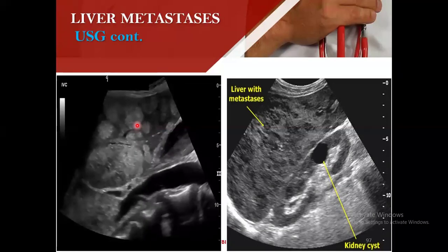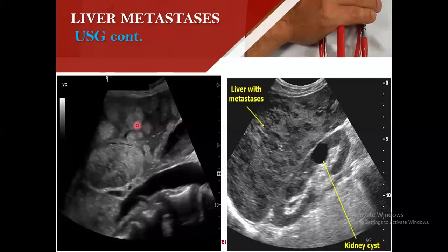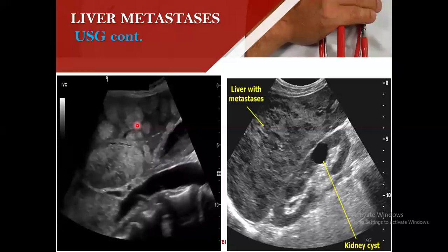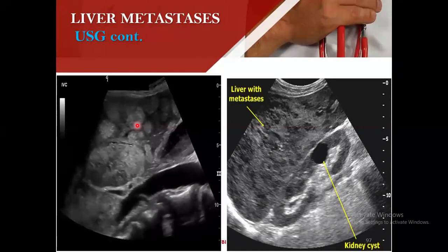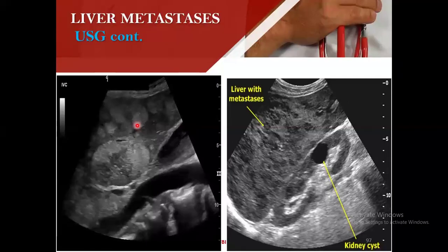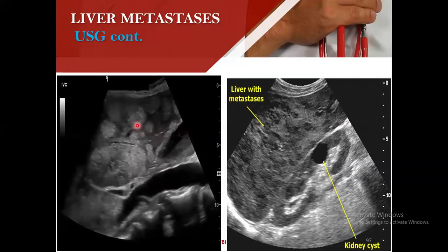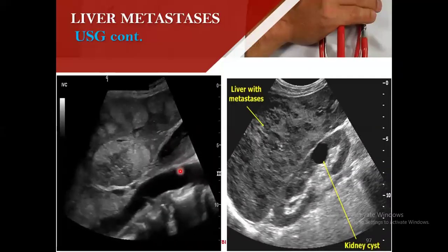So it's better you use respiration. The inferior vena cava responds to breathing in and out. Once you breathe in, the inferior vena cava will move with the breathing. And when you breathe out, the size will also move with the breathing out. You will see that the size is opening and closing with breathing in and out. But the portal vein doesn't do that.